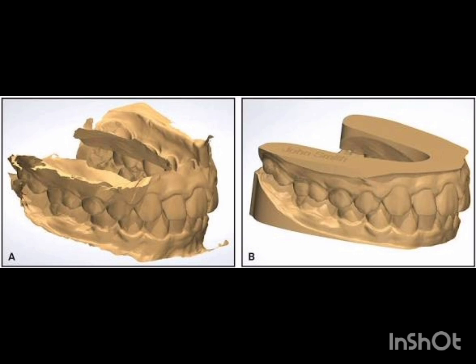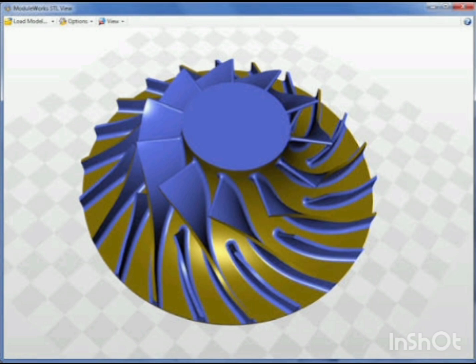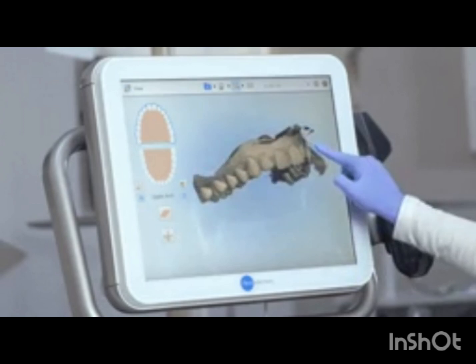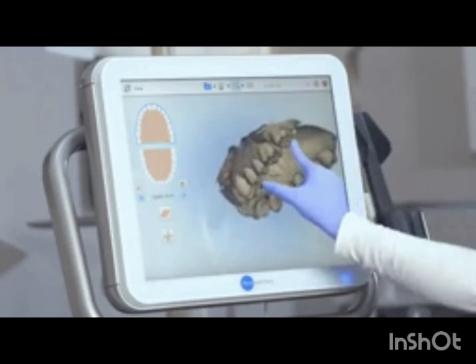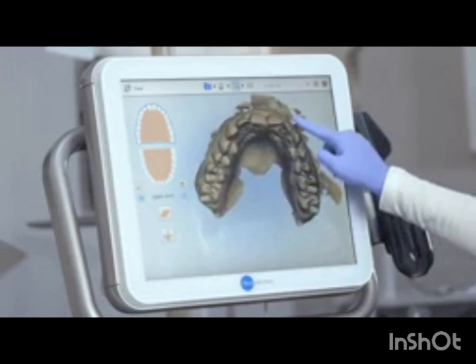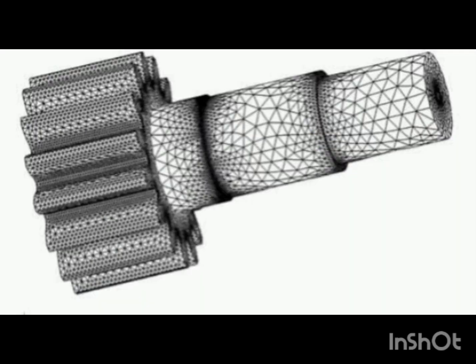Now, how is it created? So, the process begins with the intraoral scanner. The scanner captures thousands of overlapping images while moving around the patient's teeth. The sophisticated software stitches these images together to create a complete three-dimensional digital model. Once the scan is complete, the software converts this model into an STL file, and before exporting, the clinician should inspect the digital model for missing areas, holes, distortions, saliva artifacts, and stitching errors.